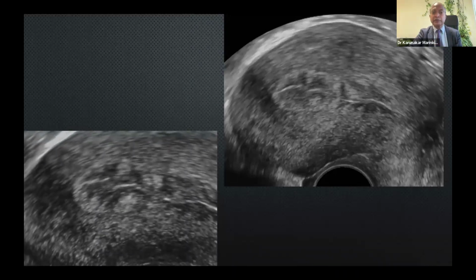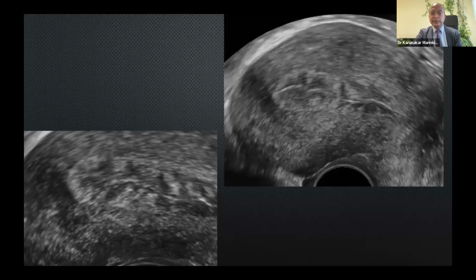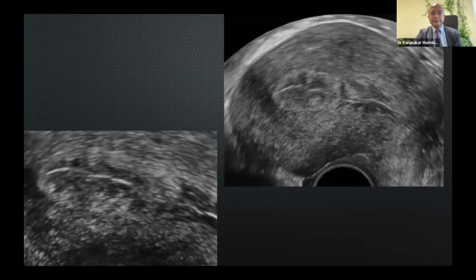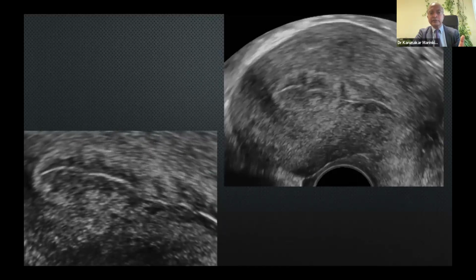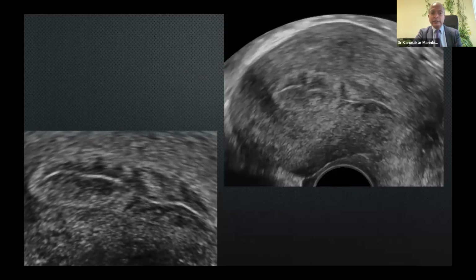I did a hysteroscopy for her. She doesn't have any polyp. But that's unnecessary surgery, unnecessary blaming of implantation failure. So this is a peristalsis of the endometrium. You can call it junctional zone contractions, or rehearsal pains for labor pains.